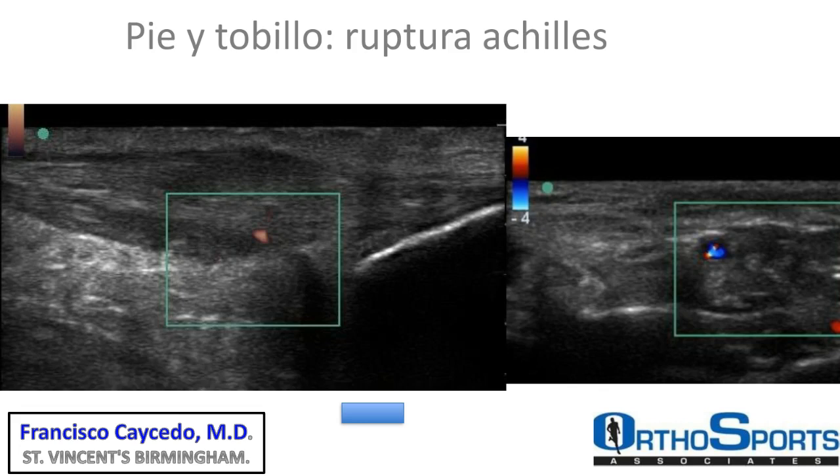So why is it important? Because remember, the pathology and the anatomy change dramatically in every patient. So you can see in this patient what is the location of the innervation and the irrigation. So with that, you can plan what kind of approach you can do. You can do more middle, you can do more lateral, and you can do more posterior.